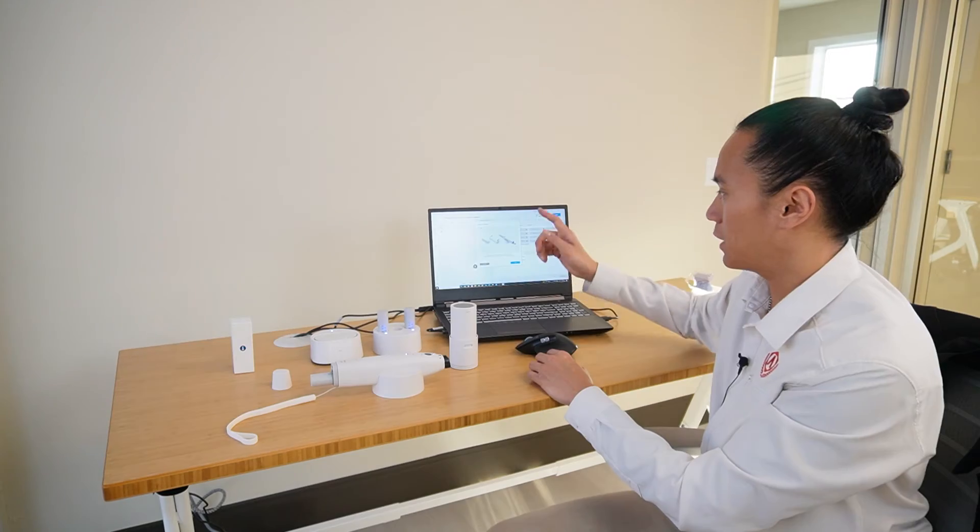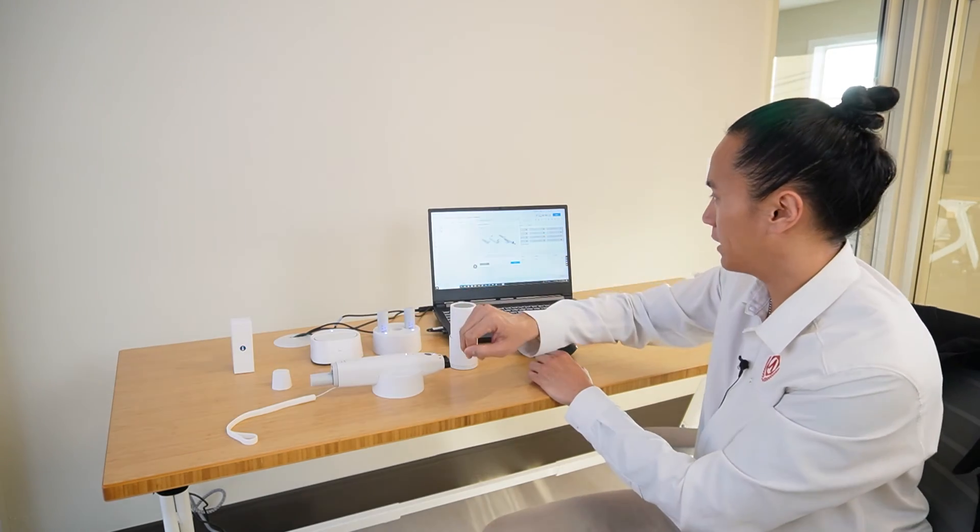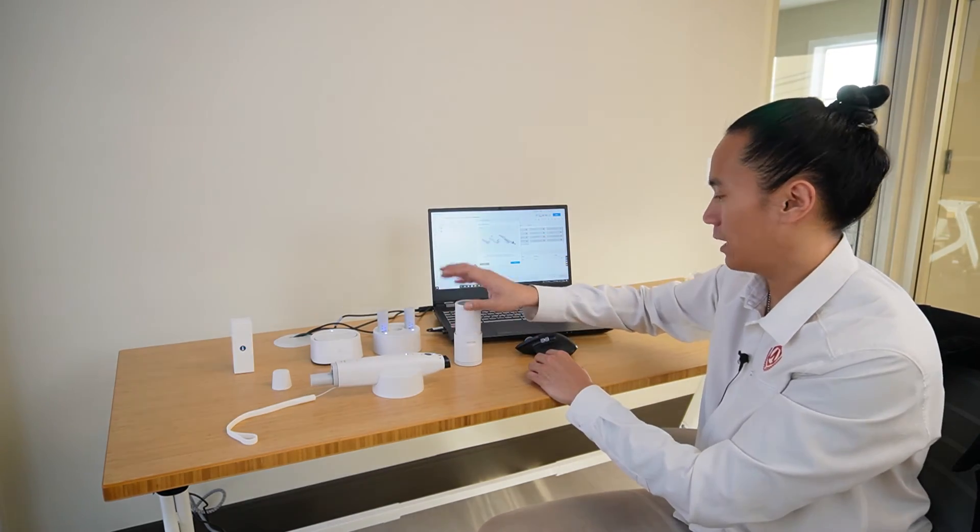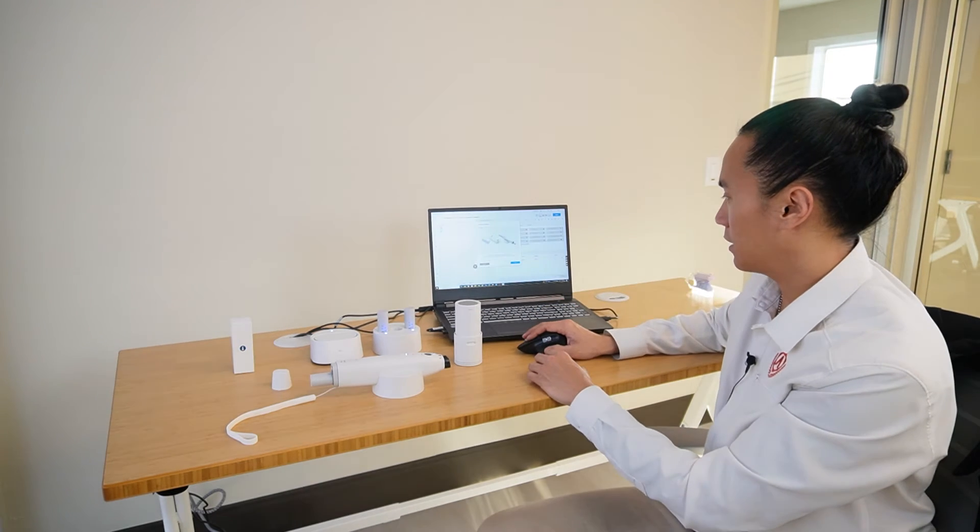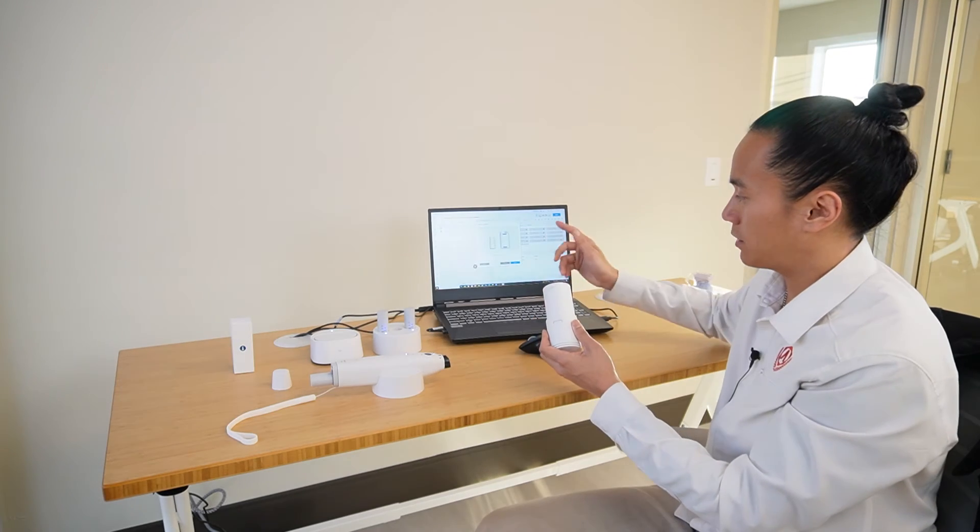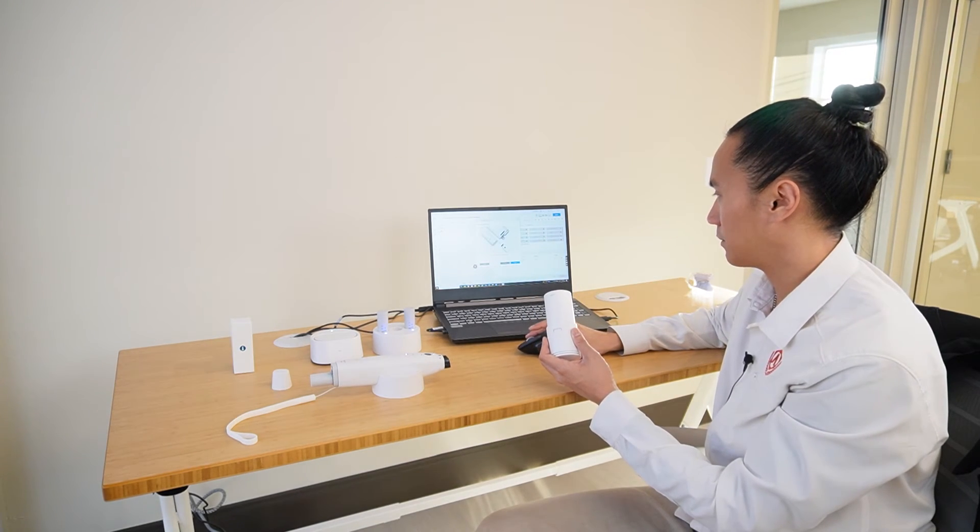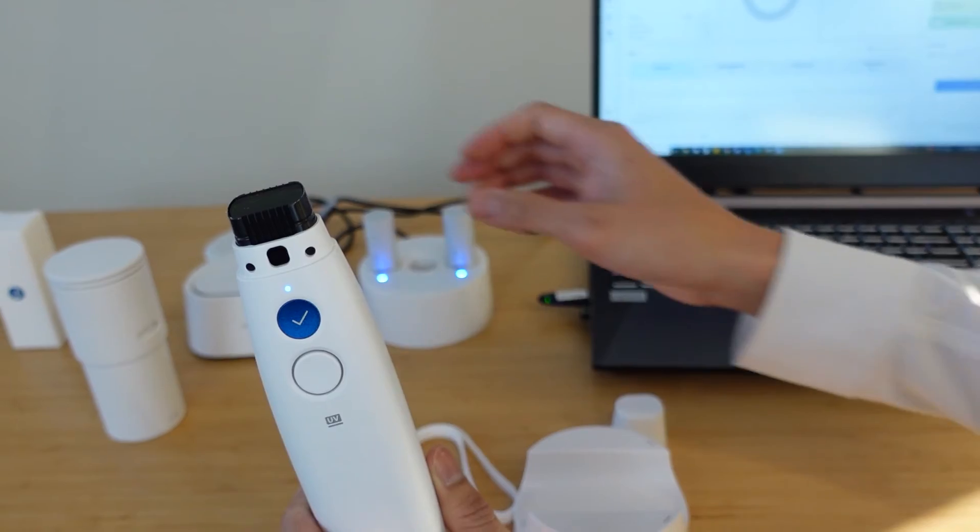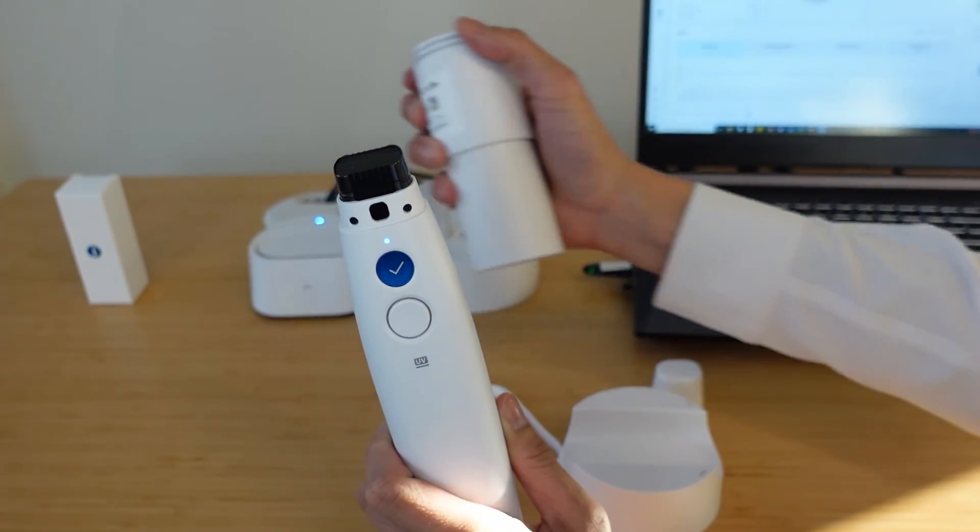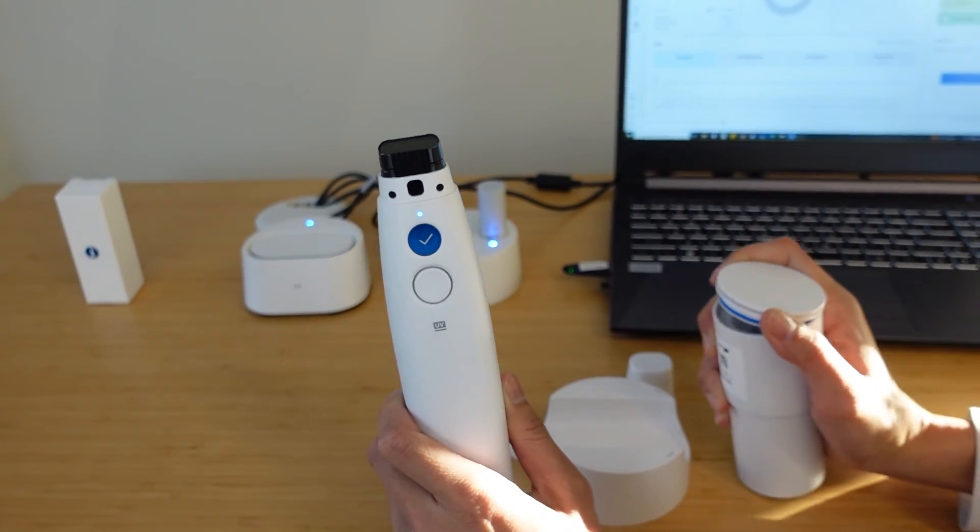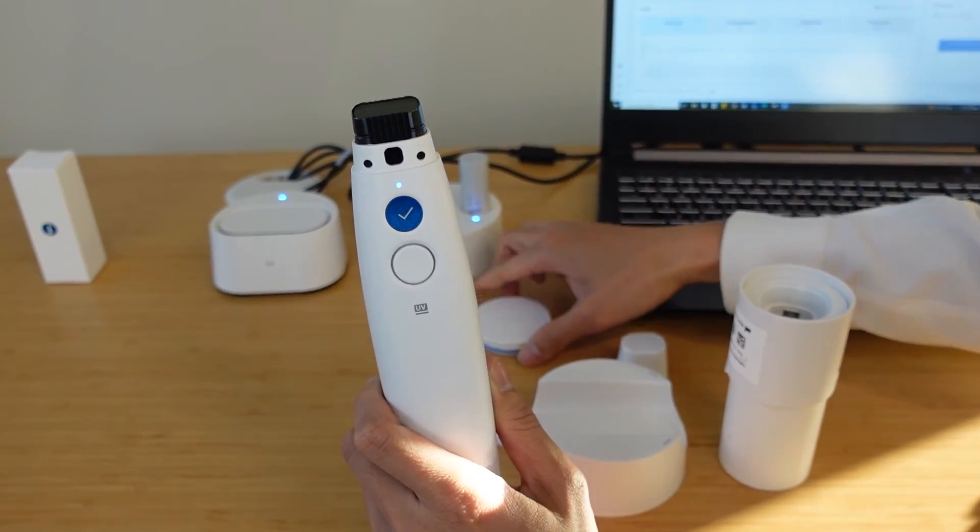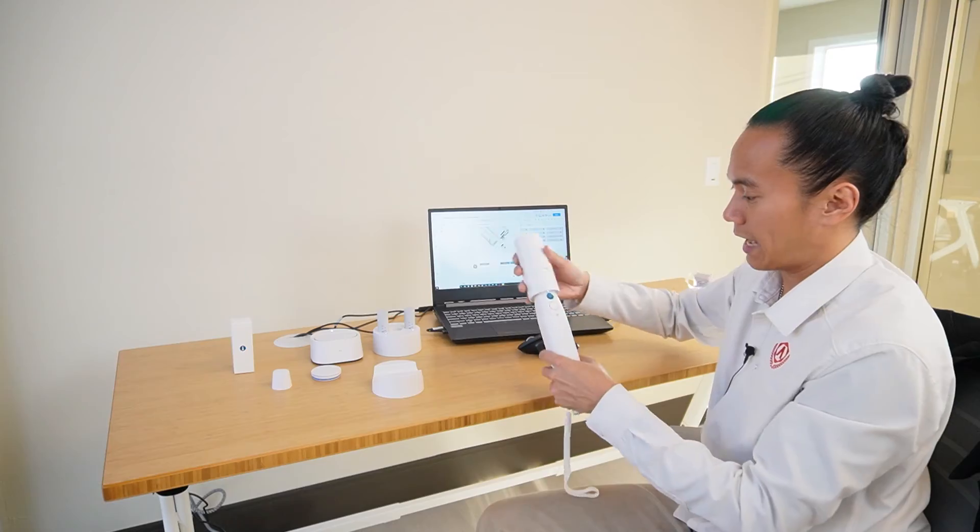Once we get prompted, just make sure that we have a battery inside the scanner, your calibration tip ready to go, and your scanner turned on and ready. From there we'll click next. Turn the dial to position one. We've already done that. We'll click next. We're going to remove the covering for the calibration tip and place it onto our scanner here. The dial should be facing upwards, just like that.